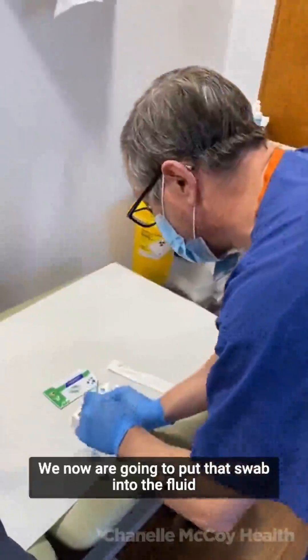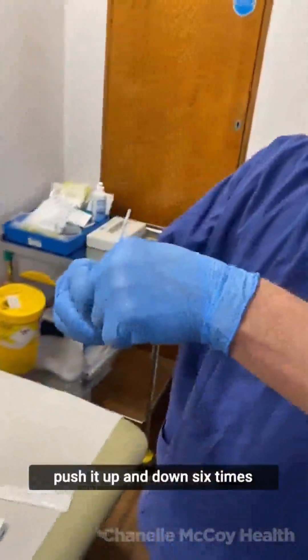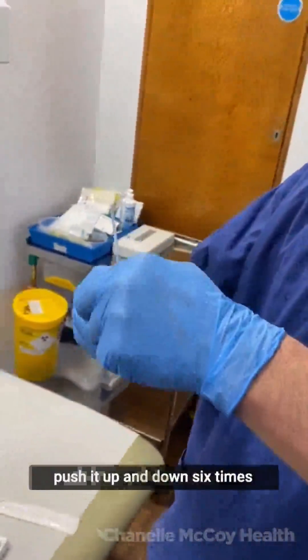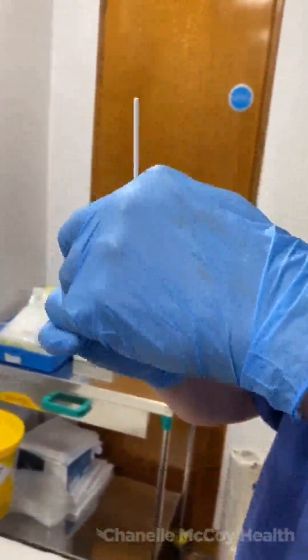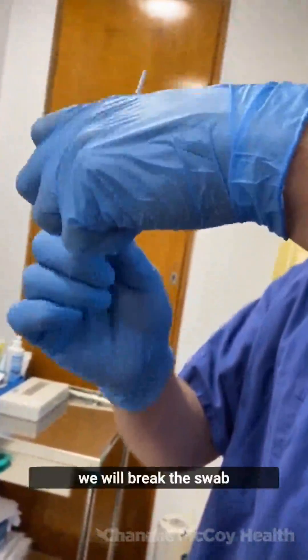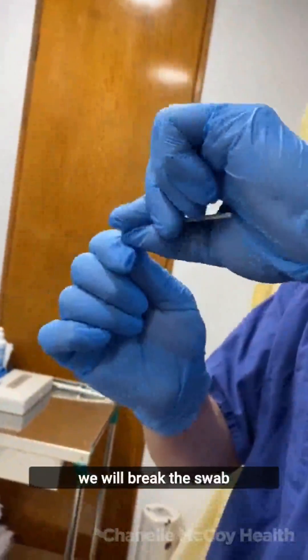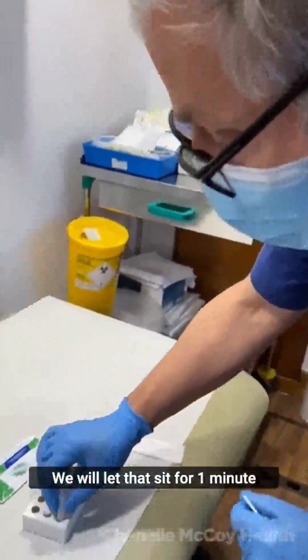We're now going to put that swab into the fluid, push it up and down six times, and then we will break the swab. We'll let that sit for one minute.